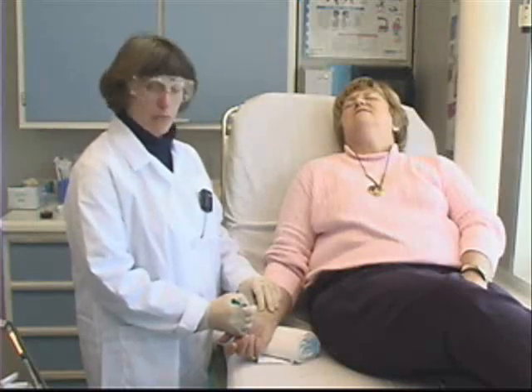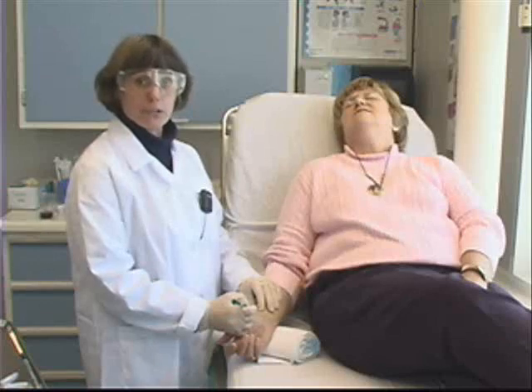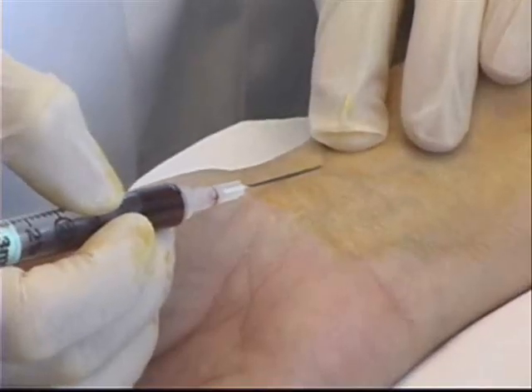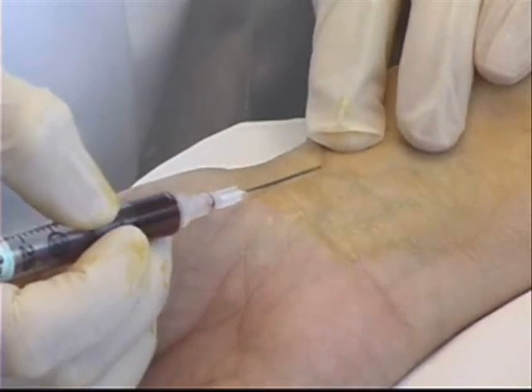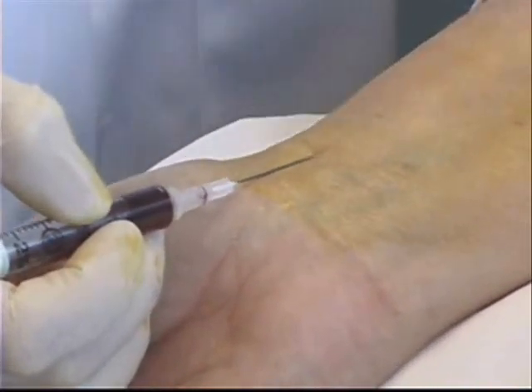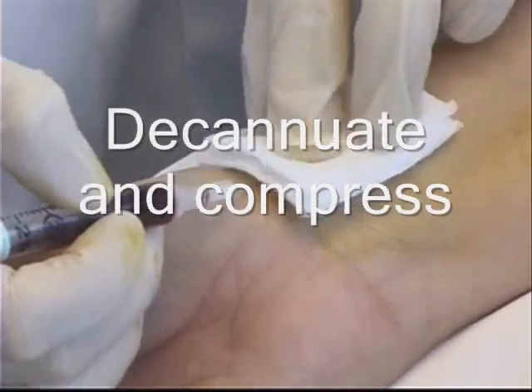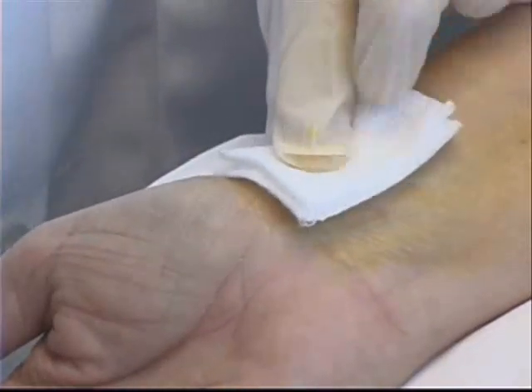An adequate amount of blood in the syringe would be one and a half to two cc's. Once I've obtained that adequate sample, I'm going to cover the area with my two-by-two gauze and very quickly pull the needle out of the skin.